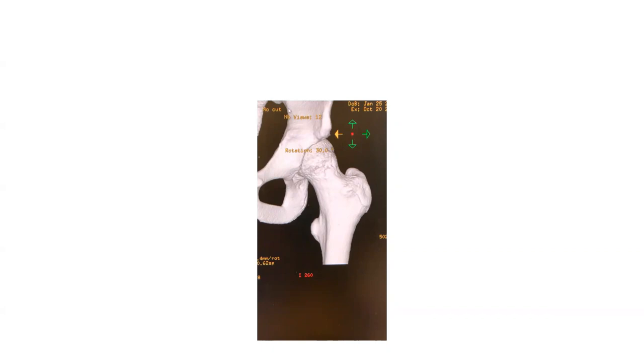There are devices that have to come out, things that are prominent under the skin. In pediatrics, we put a lot of flexible titanium rods into the bone. They have to bounce off the bone because you have to avoid the growth plates on both ends. To fix a femur, we'll put a flexible titanium rod in that creates spring-loaded stresses on both sides. Those irritate the skin because they stick out of the bone. That's how they get locked in place. So we have to take those out at 6 to 12 months.